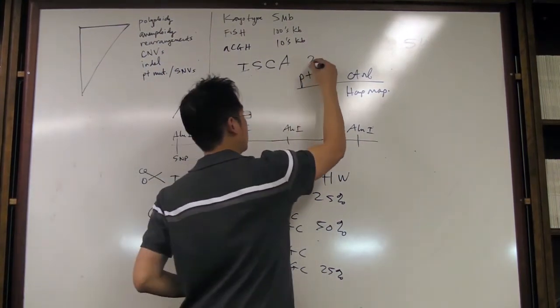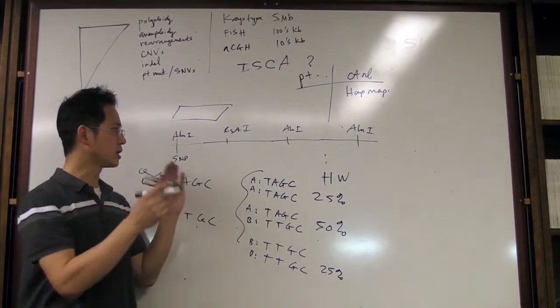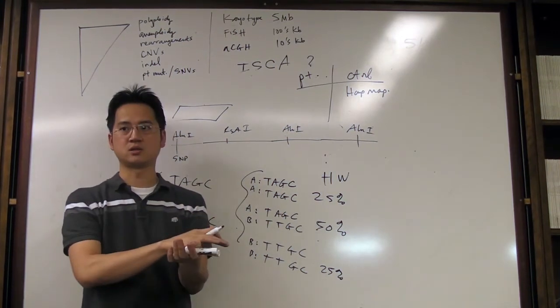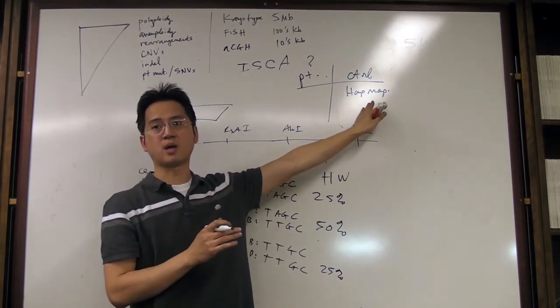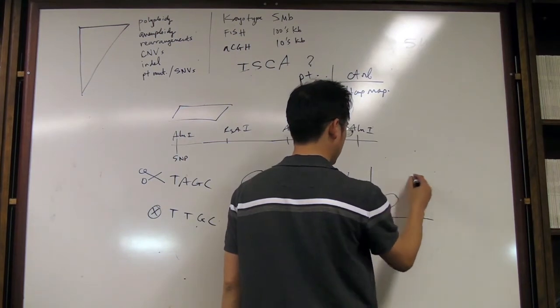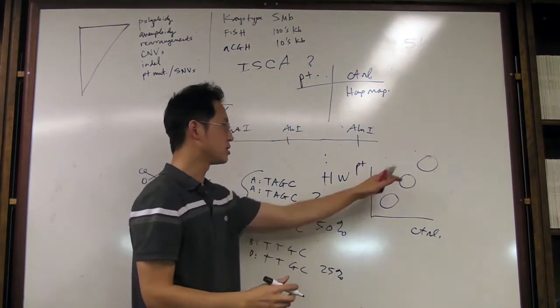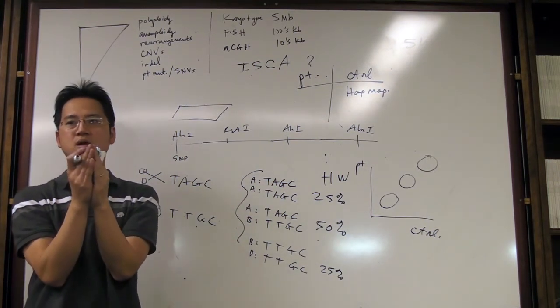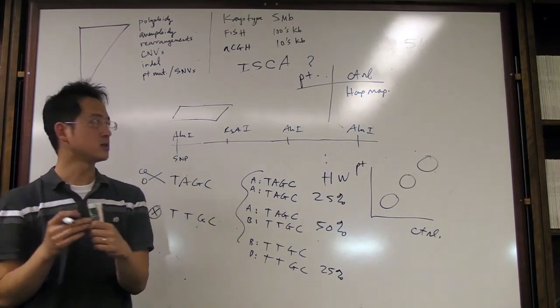Then you go to do the patient, which is an unknown, right? So you cut that patient with ALU1 and RSA1 in terms of their DNA. You do the labeling. And based on cutting or no cutting, the labeling will be different. And it will hybridize differently to the chip and give you a signature that's either similar to the HapMap control, or very different from the HapMap control. And in the end, based on if it's an AA state, AB state, or BB state, you will be able to do something that's called clustering between patient versus the control. And you'll be able to tell whether or not the patient has AA. If the patient matches perfectly with control, then it's maybe AA. Patient kind of matches halfway, which may be AB. Patient doesn't match at all, then the patient probably has some BB. So that's how you do the SNP genotyping.